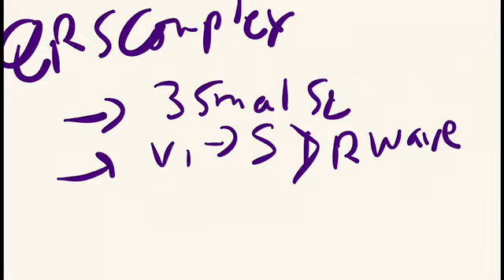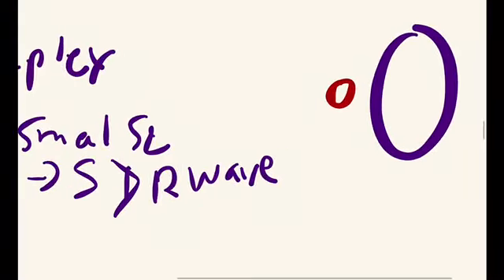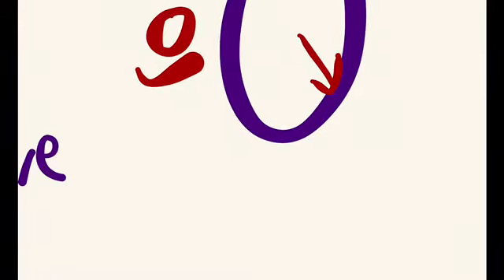We have talked about this in the basics of the ECG. So this is our heart, this is V1. Now why is the S wave greater than the R wave? It is simple, because the left ventricle has more muscle mass, and it is influencing the vector more. Because it is influencing the vector more, there will be a more negative depolarization vector. So the vector from the ventricular depolarization is going away from lead V1.